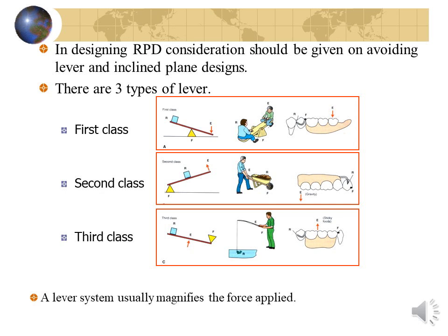An understanding of simple mechanics applied to the design of the RPD can help to accomplish the objectives of the preservation of oral structures. In designing RPD, consideration should be given to avoid levers and inclined planes. The direct retainers and the minor connectors slide along the guide planes of the teeth and can act as inclined planes if not prepared correctly.